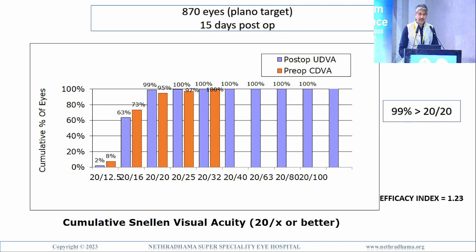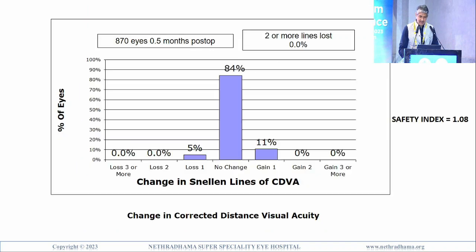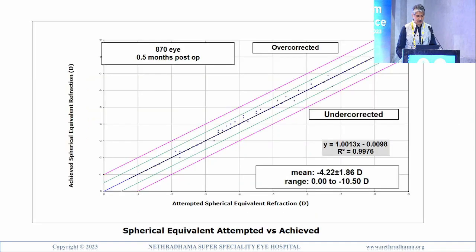So the efficacy index was excellent, 1.23. And if you look at the safety index, it is 1.08. If it's more than 1, it's very good. So 84%, no change, 11% gained 1 line, and 5% lost 1 line. There were no eyes that lost more than 2 lines of best corrected visual acuity.